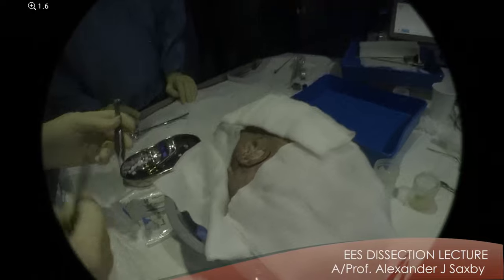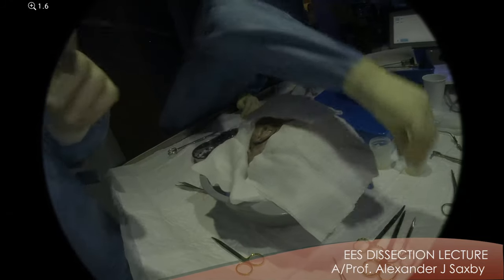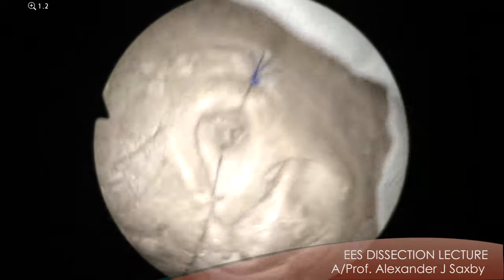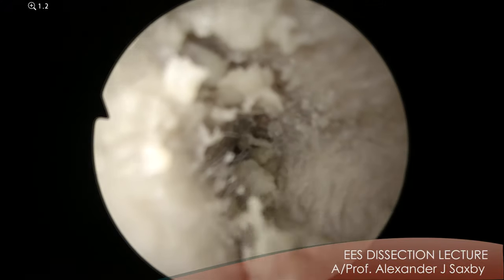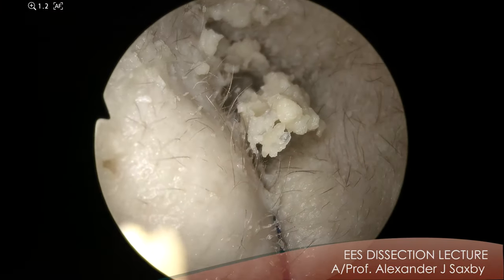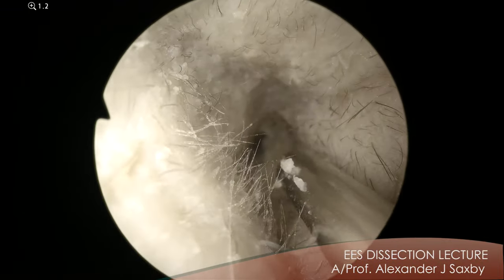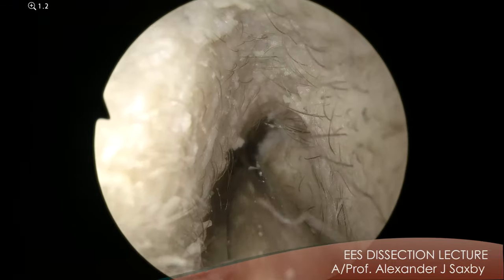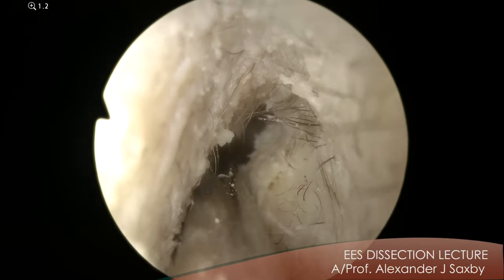So the next thing to do is to remove the hair and any wax. So we'll just use a round knife. A small point I mentioned to a few of you yesterday: the way you hold the scope. You can see that I'm holding it basically in my fingertips. There are a lot of different ways of holding the scope, and a lot of the great EES surgeons do different things.